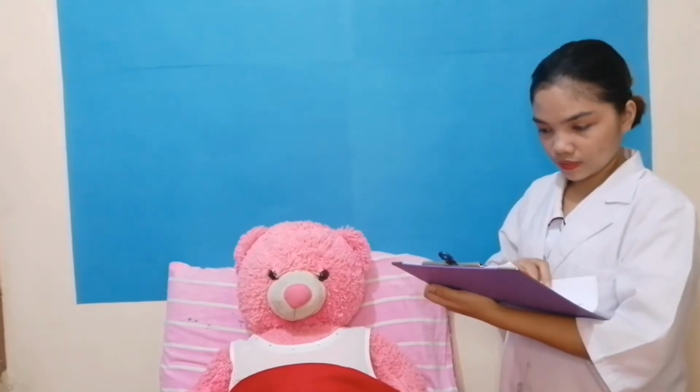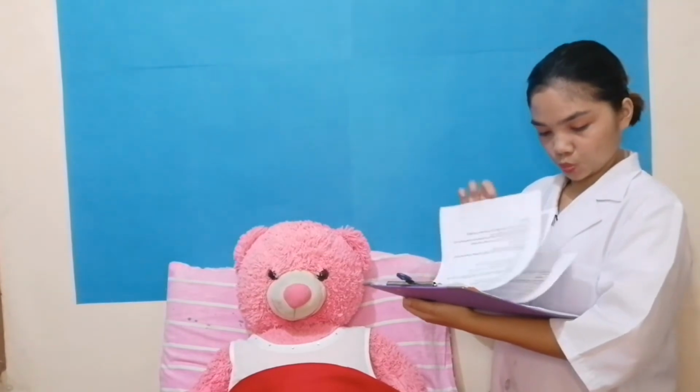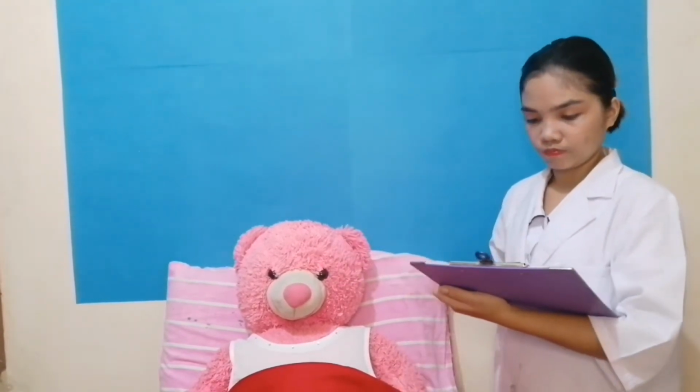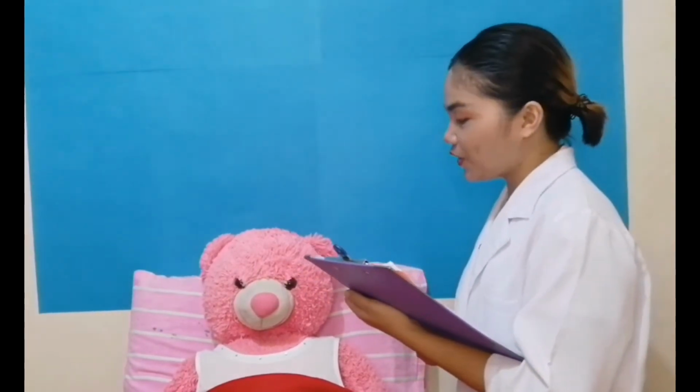The first one is to check the doctor's order. Catheterization is done only with a medical order. Next is to assess whether the client is allergic to iodine or plaster. Povidone iodine is often used to cleanse the area before catheterization. Excuse me sir, may I ask if you're allergic to iodine po? No? Okay, thank you sir.